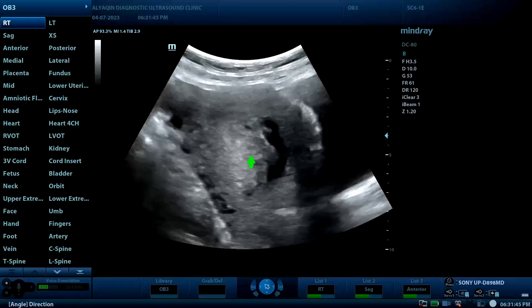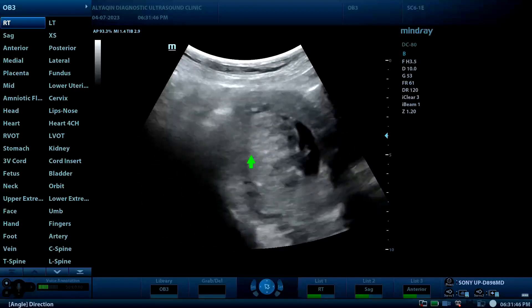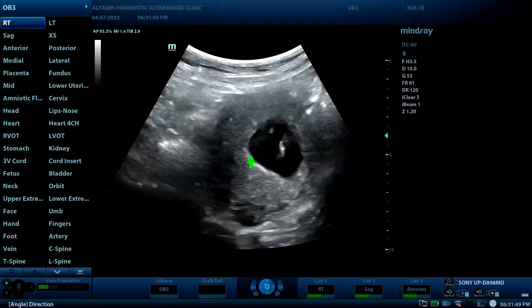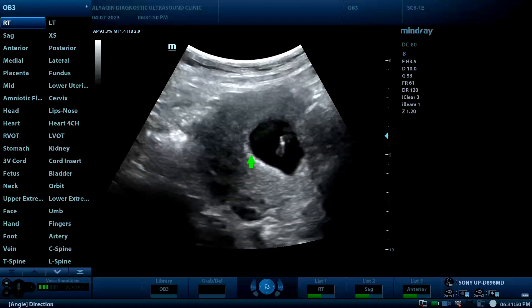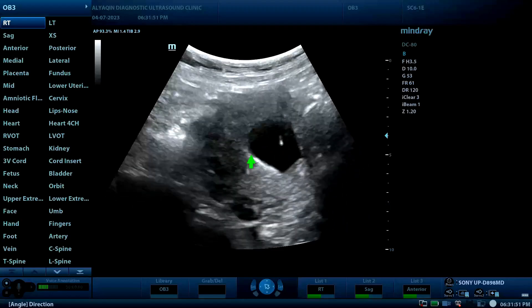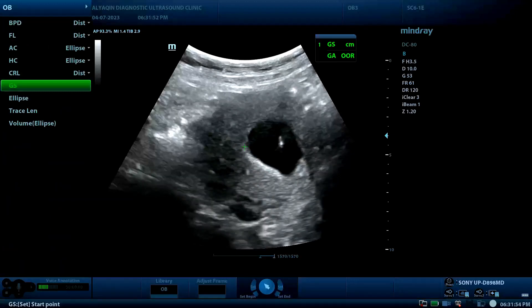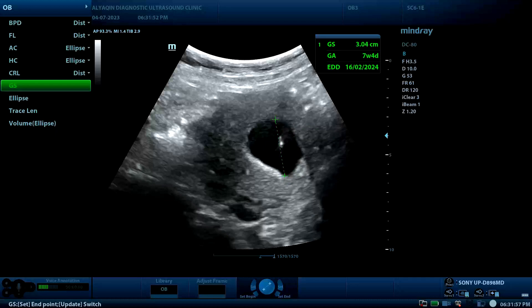Regarding the gestational sac size, this corresponds to approximately seven weeks plus four days.